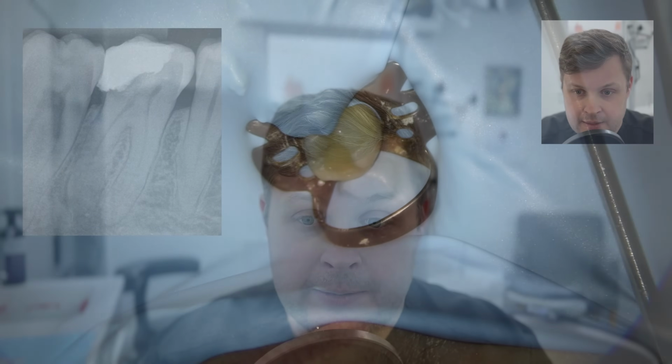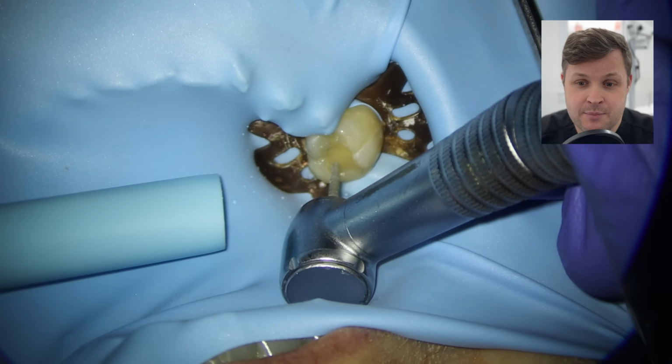This is a radiograph of a lower right 6. This is an external referral, sent to me by another dentist, and you can see that there is a leaking filling. We've got a composite filling in the tooth with secondary decay underneath, and there is widening of the lamina dura. In fact, when this filling was removed, it was obvious that the canal space was exposed, and therefore the pulp was necrotic.